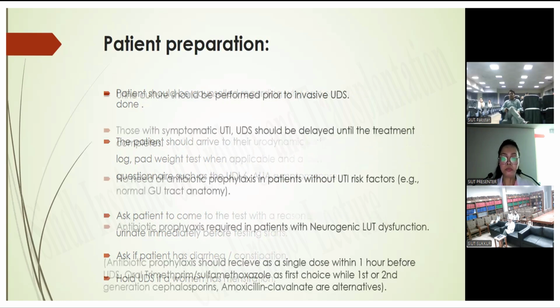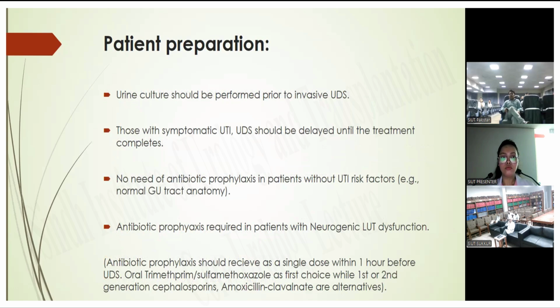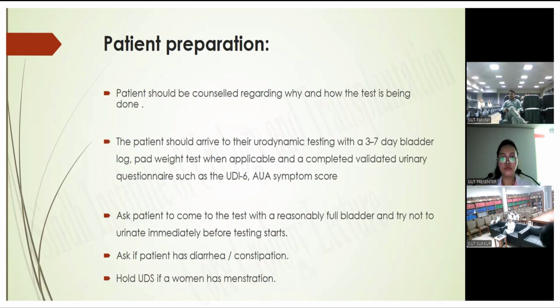So at this point as well, I'll just go back to the previous slide. Again, the point is very important that patients should come with a voiding diary, FVC, and the symptomatology should be reconfirmed before starting the UDS as well.